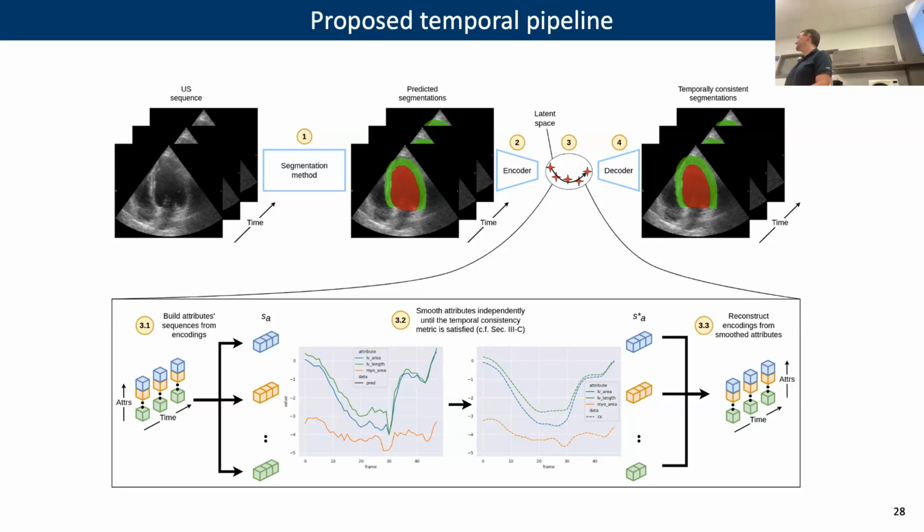Yeah, and how do you know if you're smoothing not enough or too much? We try to look at cases that do not happen so often, where there's strong motion or things like that, and we have shown that it was still working decently. Of course, we can lose a little bit, and this is one of the limitations. Since you smooth, you can smooth too much. So it's a compromise, but in 90 to 95% of the time, we haven't found things that were too smoothed by the method. It might happen for sure, but it is not common, I would say.